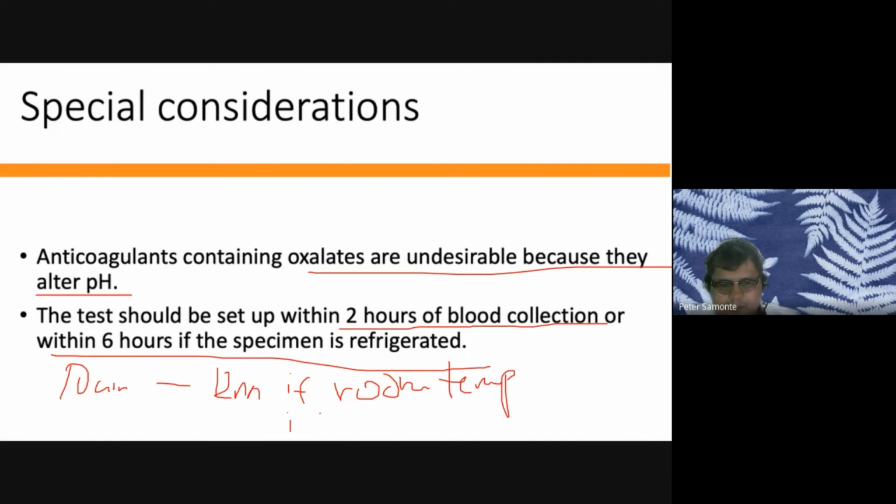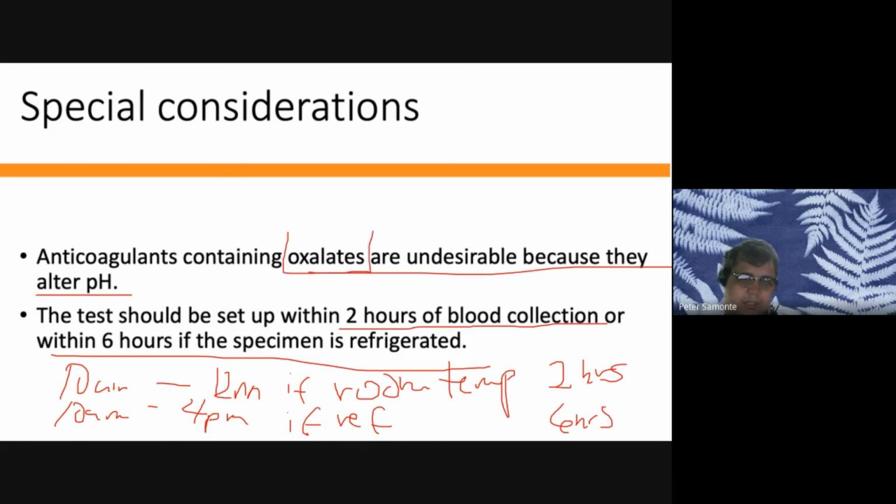But if you're going to refrigerate it, you may process it until 4 p.m. So 2 hours when room temp, then 6 hours when refrigerated.